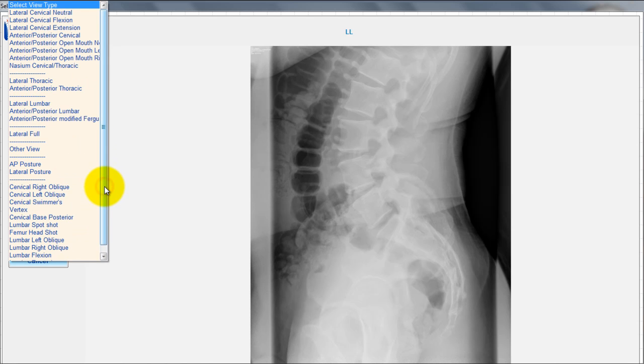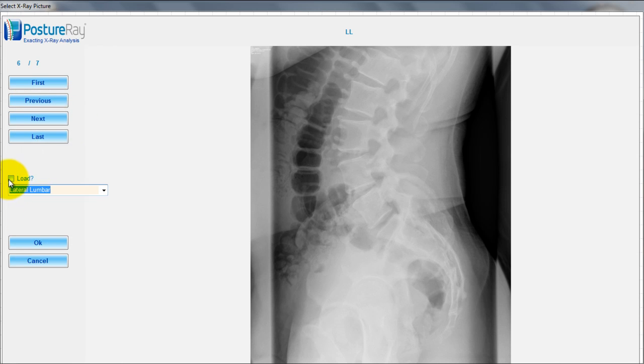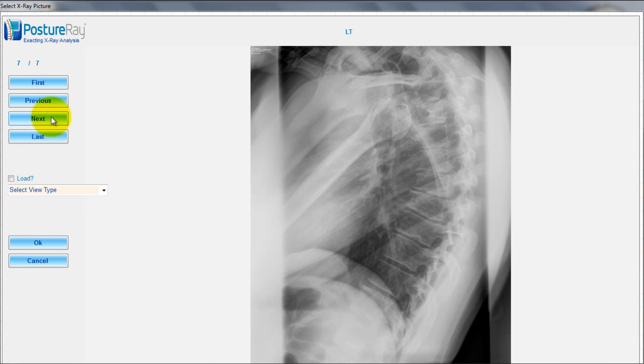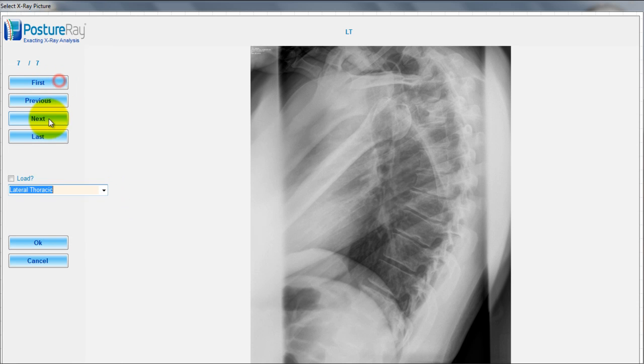So lateral cervical neutral. Load. Notice how basically we're just telling PostureRay what images are what. There's a lateral lumbar. So I just go down to lateral lumbar. Load. And we'll do lateral thoracic. You can see my problems there.